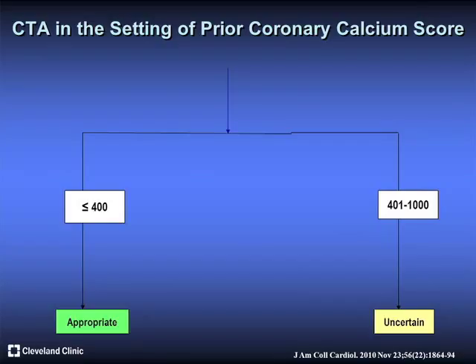So if your calcium score is greater than 400, you should probably avoid CT angio. In other words, if you have a 75-year-old obese guy who smokes, is diabetic, hyperlipidemic, et cetera, then you are better off with a stress test or taking him to the cath lab as opposed to sending him for a CT angio.